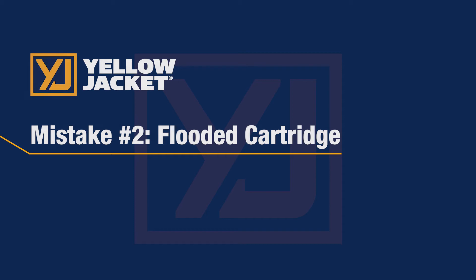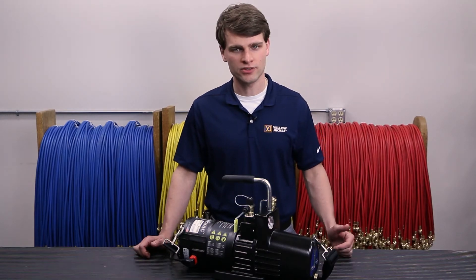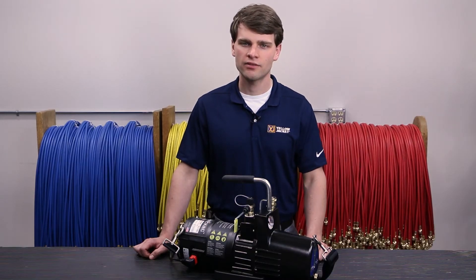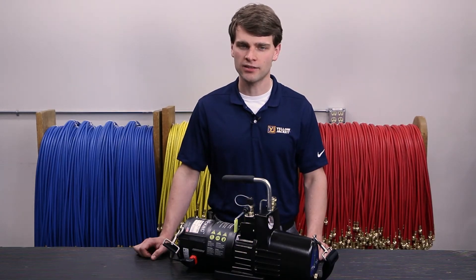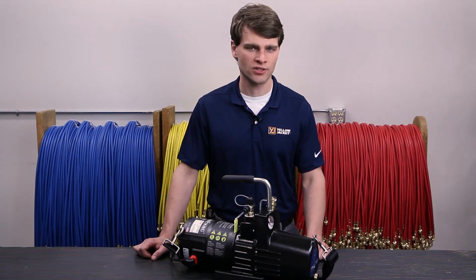Another common mistake you may run into at startup is a flooded cartridge. A flooded cartridge occurs when there is oil in the cartridge, either from the cartridge sitting in oil while in storage or when shutting off the pump while it is still under vacuum. This normally isn't a problem when the pump is started with the intake open, as the oil can be expelled from the cartridge easily. But if the cartridge is flooded and the intake is closed off, the pump can have difficulty starting.